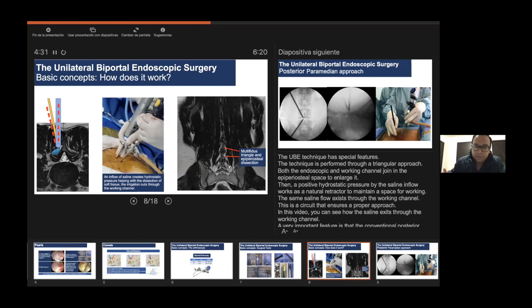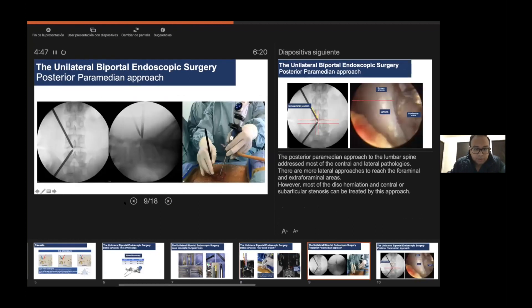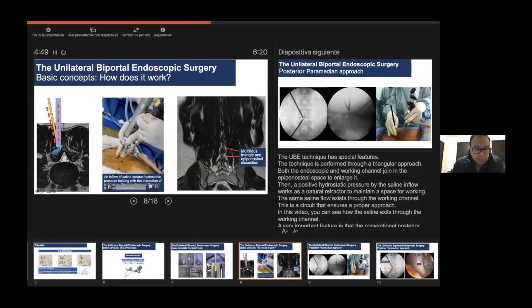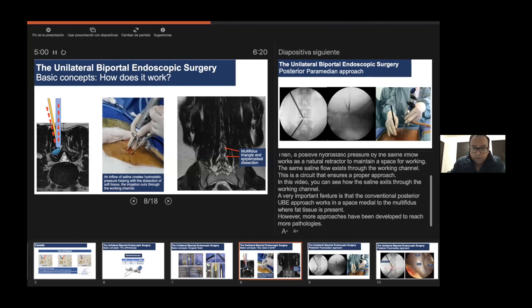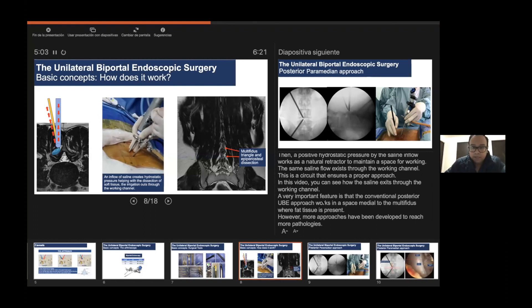Then a positive hydrostatic pressure by the saline inflow works as a natural retractor to maintain a space for working. The saline flow exits through the working channel. This is a circuit that ensures a proper approach. You can see in this video how the inflow saline passes through the endoscopic channel and exits through the working channel.